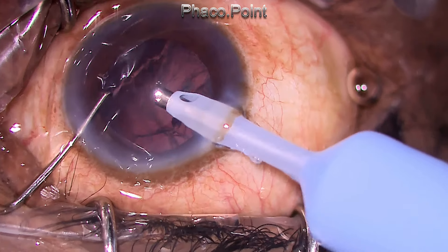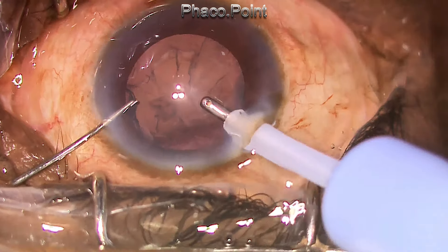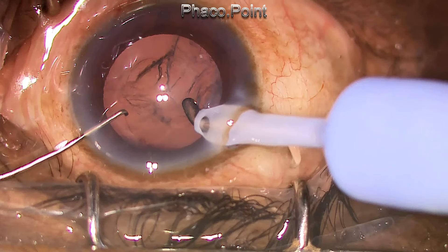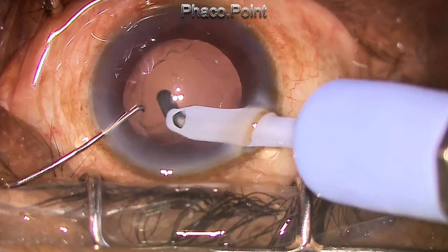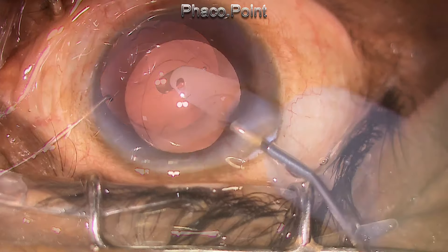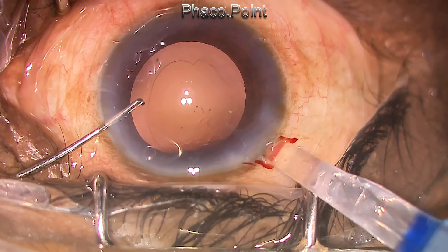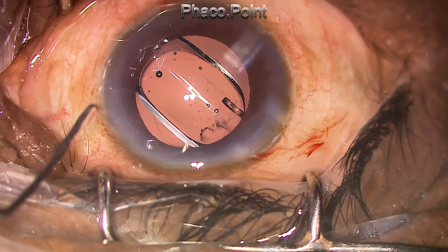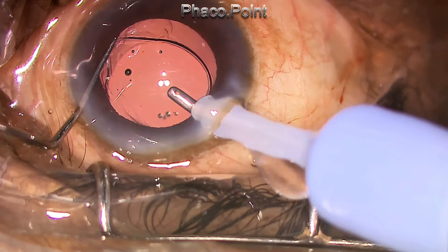Usually it is said that a superior run-off is probably safer than an inferior run-off because the inferior run-off bears the brunt of the phacoemulsification trenching and mechanical forces. But if you follow this technique of simple hydrodelineation and avoid hydrodissection, then a rhexis run-off at any part — whether inferior or superior — and even to a reasonably hard grade 3 cataract, you can easily finish phacoemulsification. When inserting the intraocular lens, make sure that you deposit the lens at right angles to the point of the tear. In this case the rhexis run-off is around the one o'clock position, therefore I place the haptics 90 degrees away from it, between the four to eleven o'clock position.